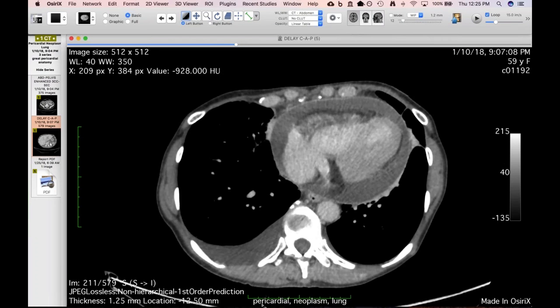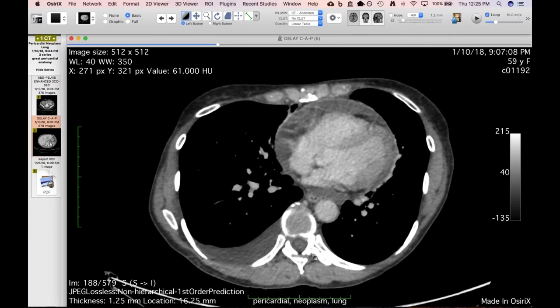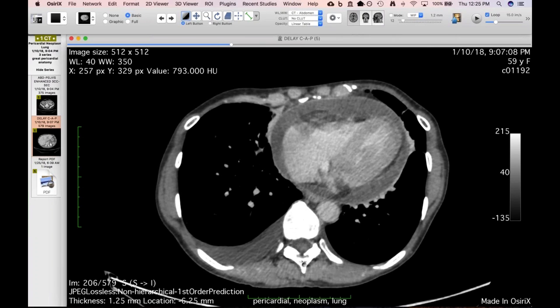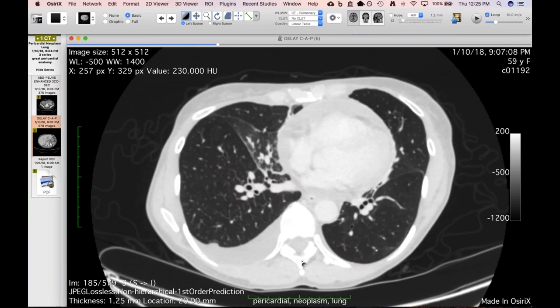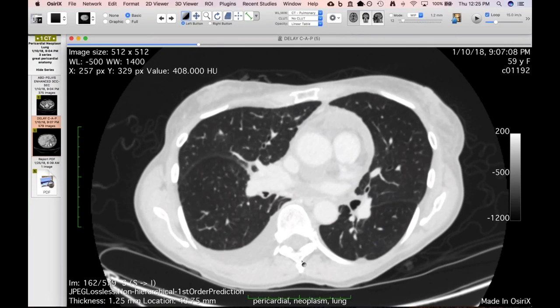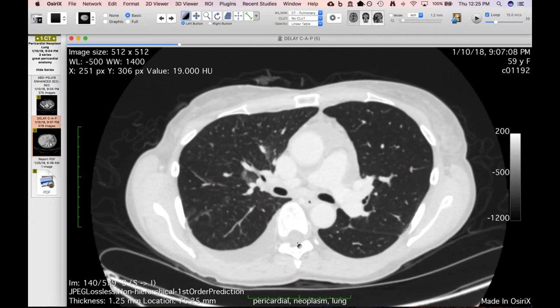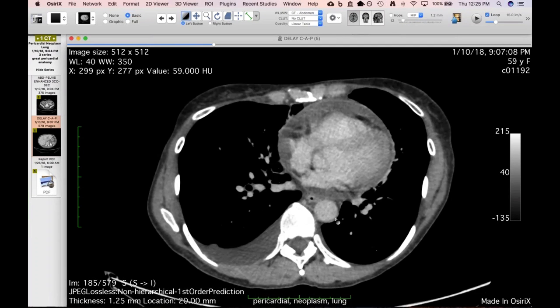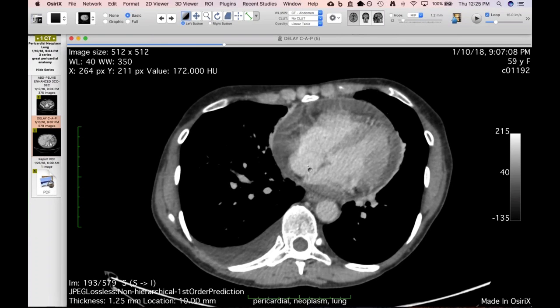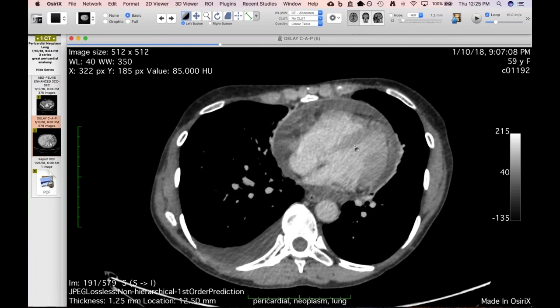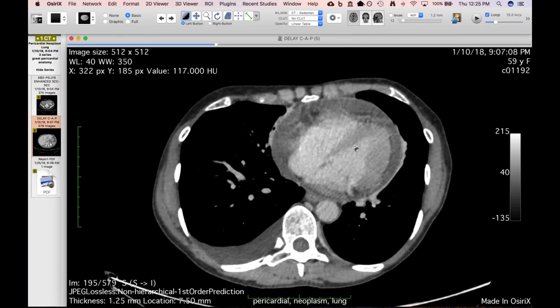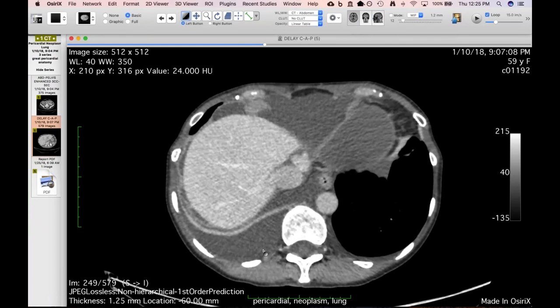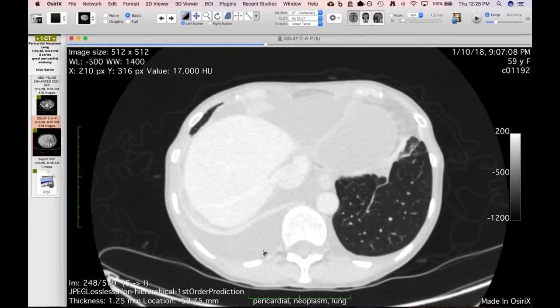The right middle lobe bronchus narrows considerably with a little bit of volume loss. I couldn't reconcile whether there was a tumor there. Some of what's seen may be edematous fluid and septal thickening from the effusion. The septal lines and peribronchial cuffs may indicate lymphangitic tumor spread.